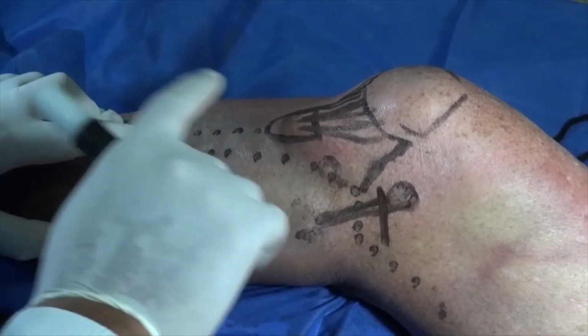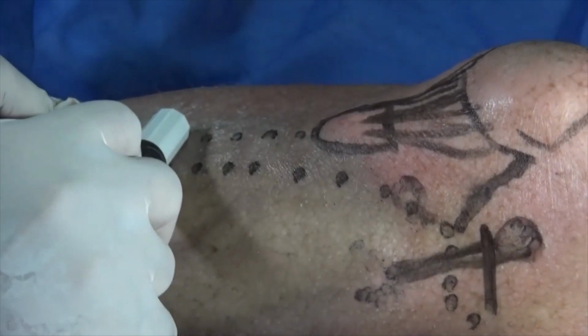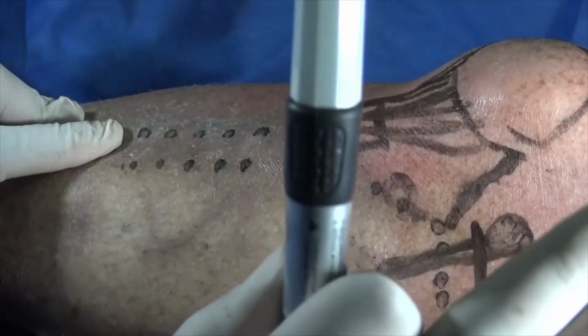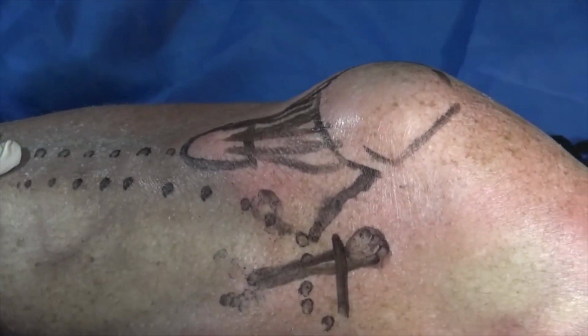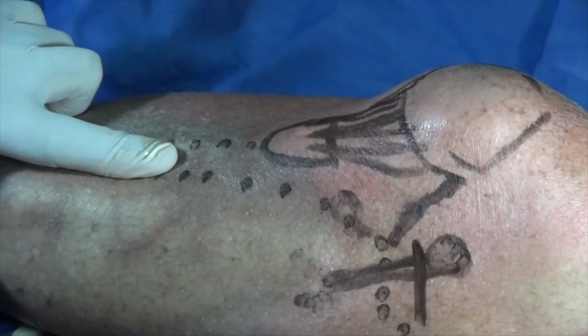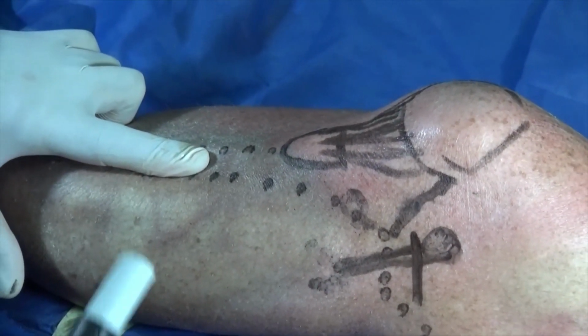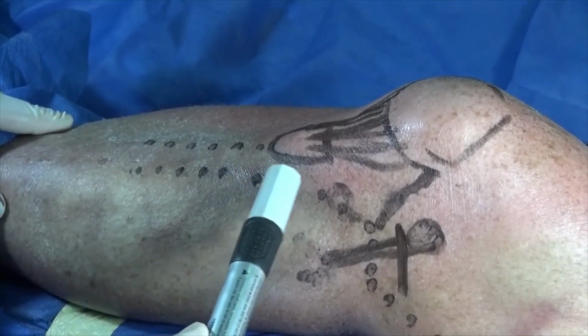For your safety and for the patient's safety, mark out the first line here, which is your anterior tibial crest. Your tibial tuberosity you've already marked from the first approach. Put one finger lateral to your tibial crest, and that will be the point of starting your standard anterolateral approach.